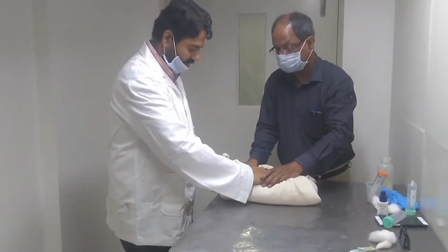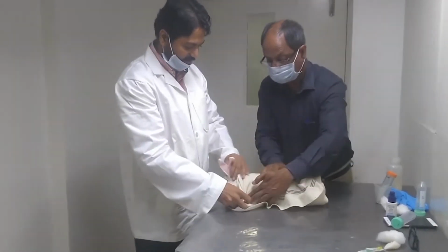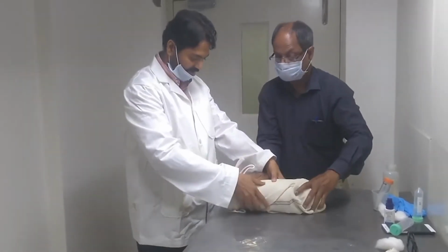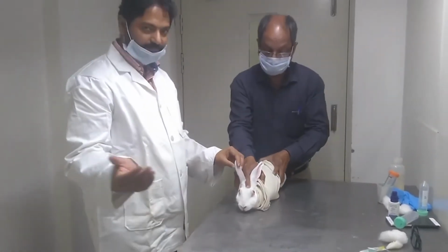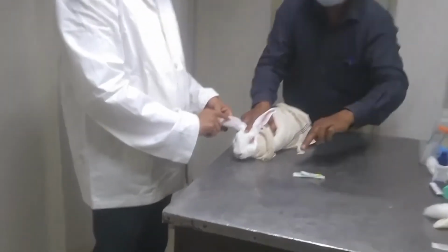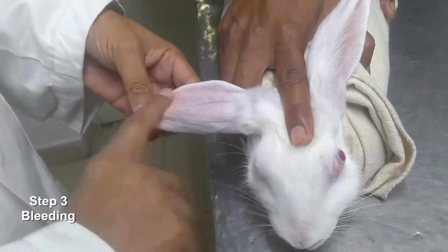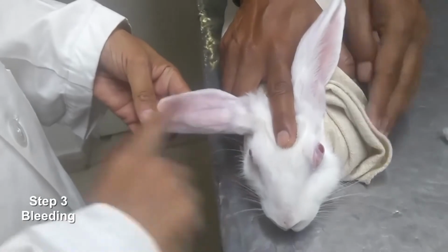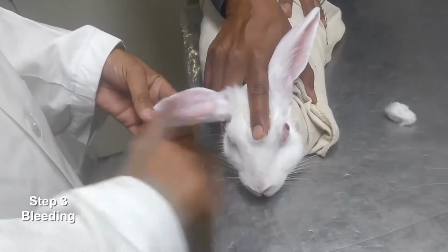Make sure that the ears are outside and the animal is restrained properly so as to reduce its movement, and now it is ready to bleed. We will bleed the animal from this mid-ear vein and we rub it so that it gets loosened up and the circulation is faster. The vein will also expand and more flow will be there.